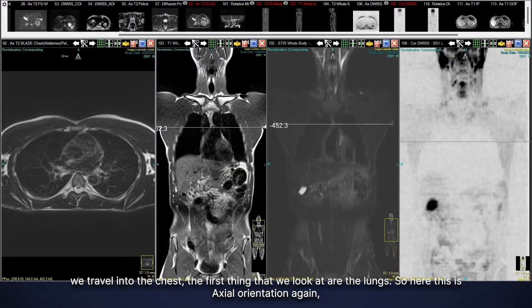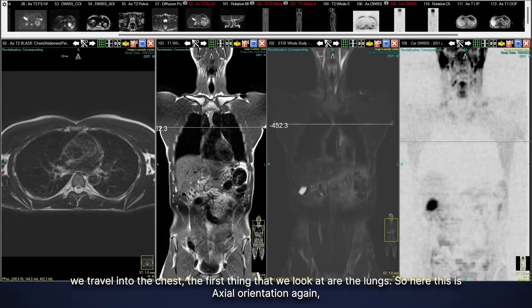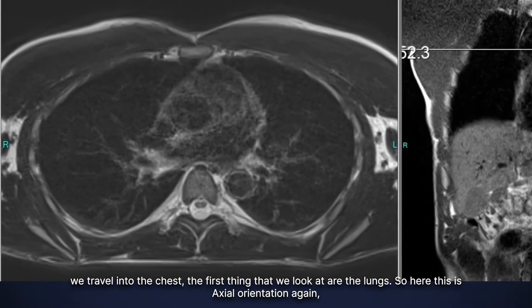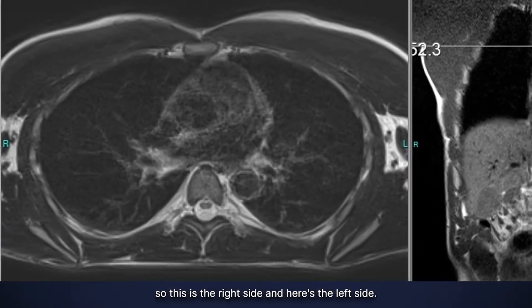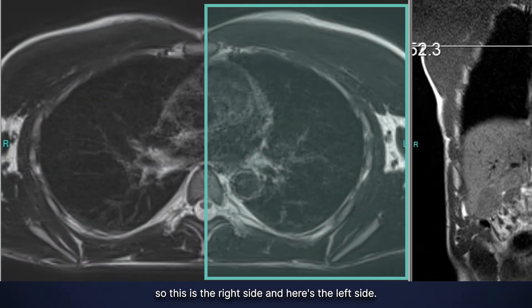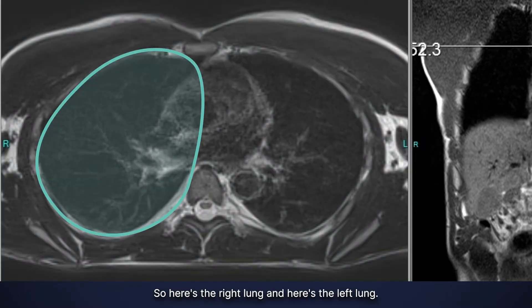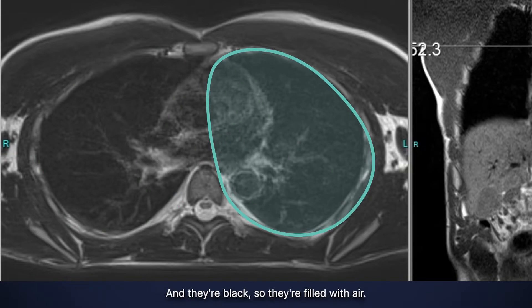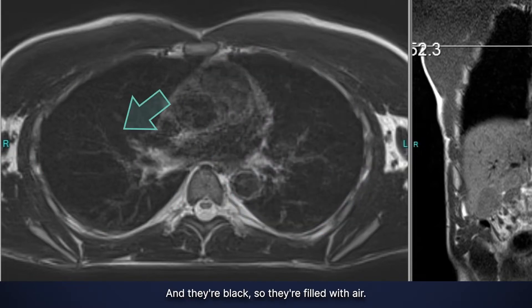Now that we finish the neck, we travel into the chest. The first thing that we look at are the lungs. Here, in axial orientation, the right side is here and the left side here. Here's the right lung and here's the left lung — they're black because they're filled with air.